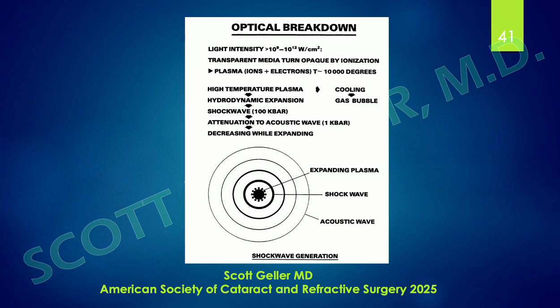So this is just a review of the optical breakdown phenomenon. You have the media, which creates ions plus electrons when the material is lased. The actual temperature can be up to 10,000 degrees, but there's not much heat there.